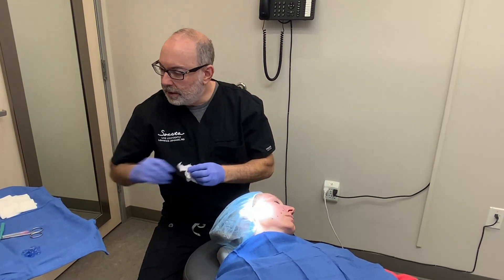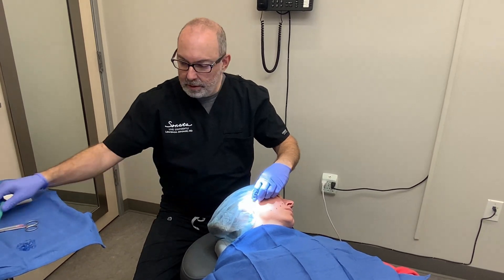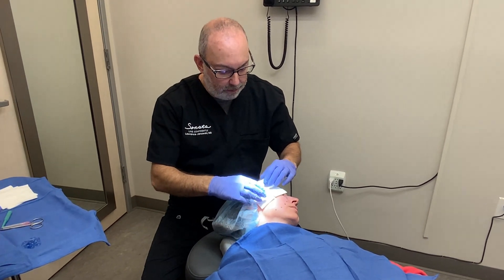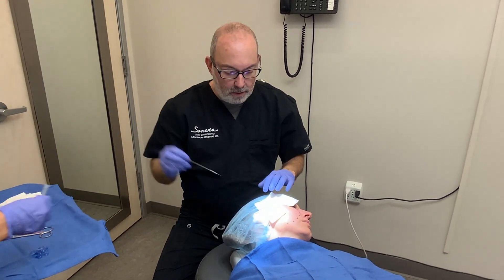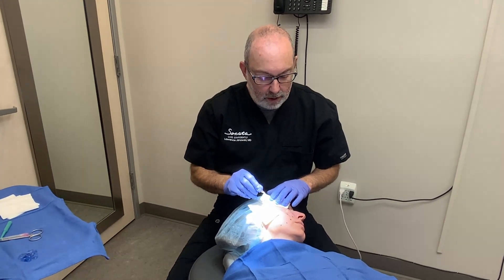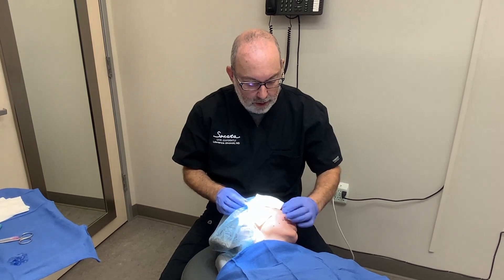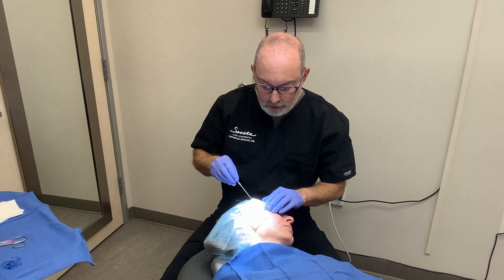Now that we got that done, I like to use a one-millimeter punch for our entry points, as opposed to a needle, which just makes a nice round opening and those heal up just fine. I'm using a split sponge here to keep the hair out of our way, and we're going to use a fine preloaded cannula. We're going to go here and here, put one here and one here, and stay in the subcutaneous plane, then create a V shape.